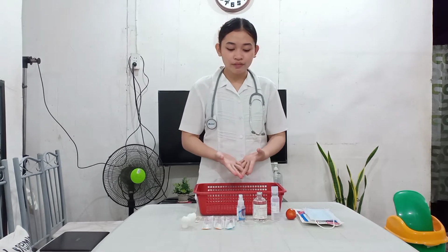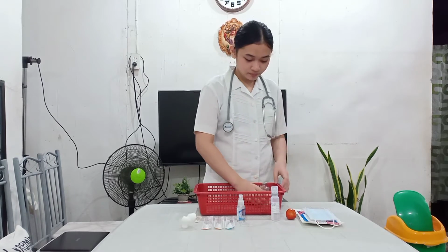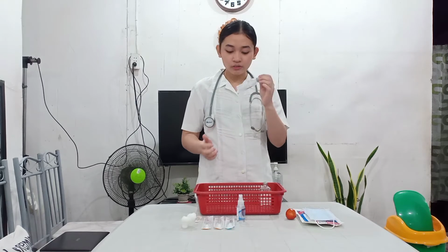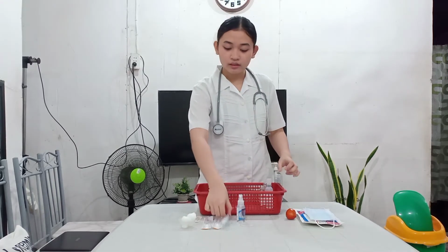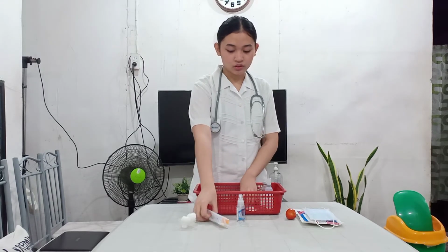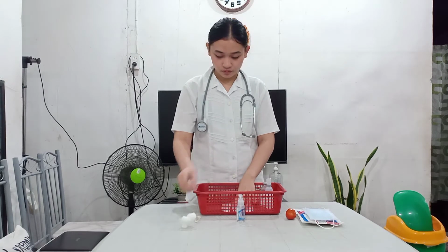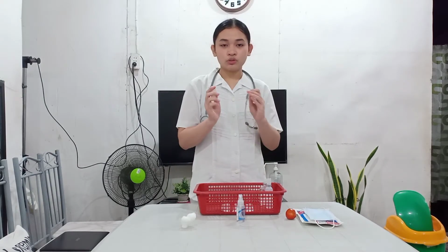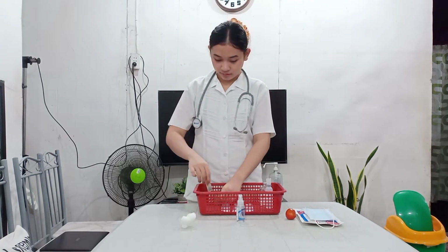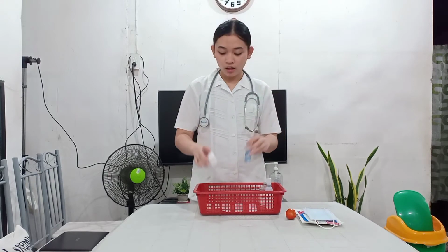We have here a vial of sterile water, an ampule of sterile water, a 3 cc syringe, 2 tuberculin syringes, 2 withdrawing needles, and a cotton swab and an alcohol.